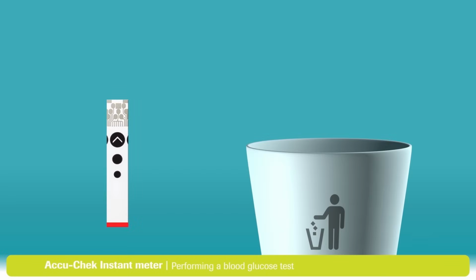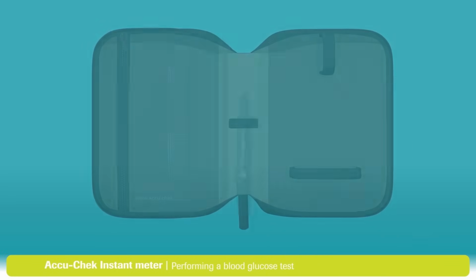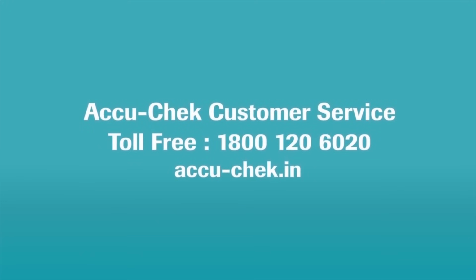One important final step: remove and dispose the used test strip. Then put everything in the carry case. You'll find more information in the user's manual that came with your meter. If you still have any questions, please visit Accu-Chek.in.